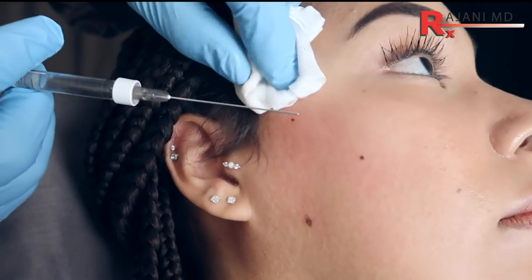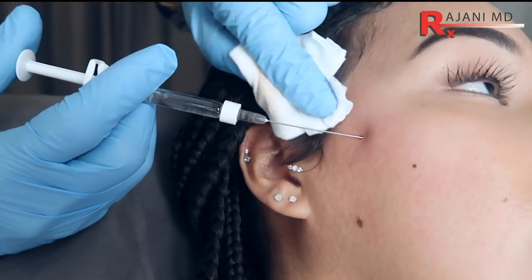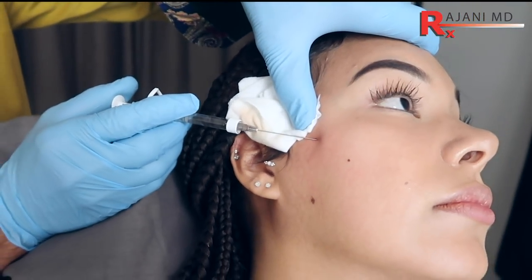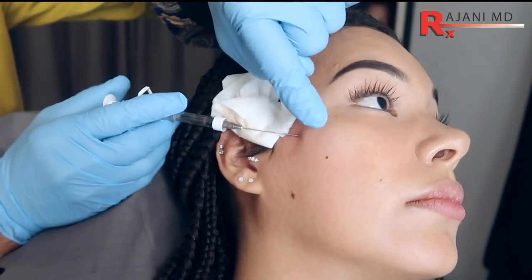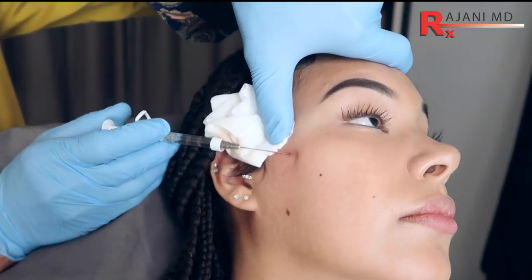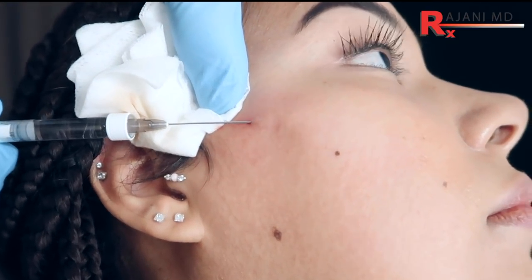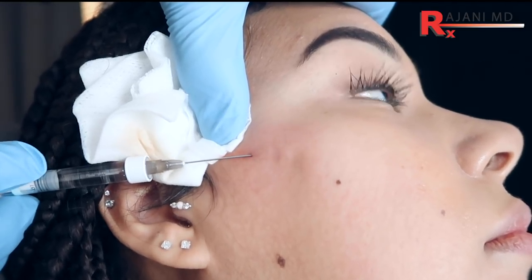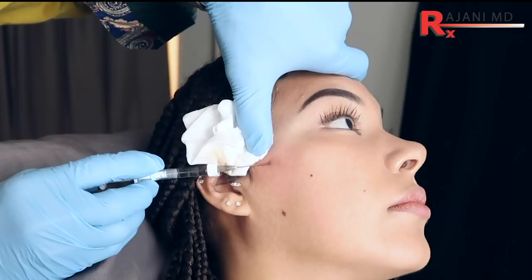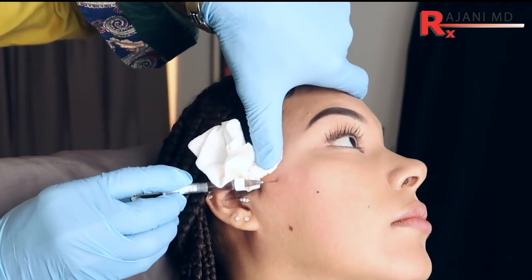I'm going to use a 22 gauge cannula and we just find our opening — usually it'll identify itself. I like to put something over the hair; it's nice to have a sterile gauze pad. This is a bit of a larger cannula so I'm hitting a little resistance. The sensation is on the skin on the outside, so oftentimes you can push harder than you think. We move past what is likely an osteocutaneous ligament. To create some space, I'm going to inject a little bit of product. We're using Restylane Lift — brand new indication for cheek mid-face cannula, which is amazing. One of seven new FDA indications that company has had in the last four years. I'm putting a little product in so I can dissect through the product, which makes it comfortable for the patient. By putting a little bit of product down and then pushing, I'm creating a potential space.